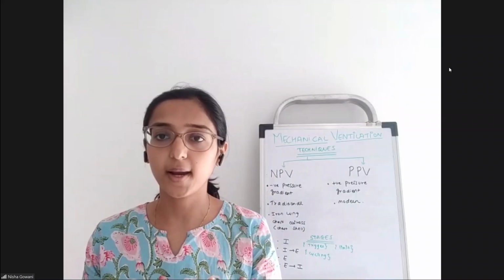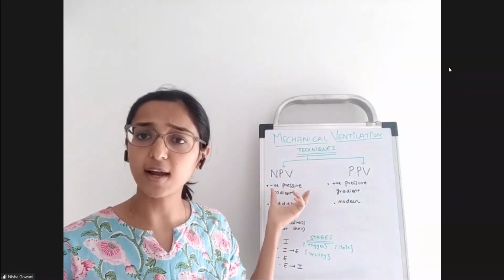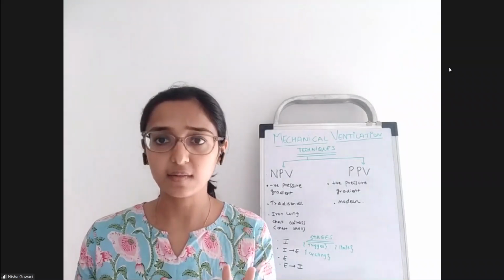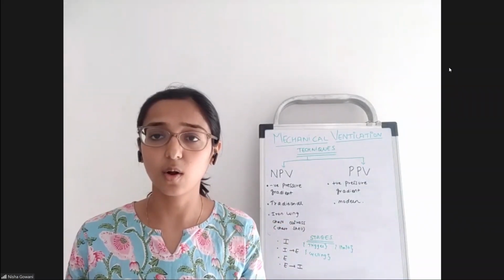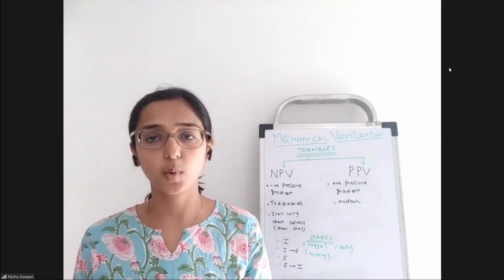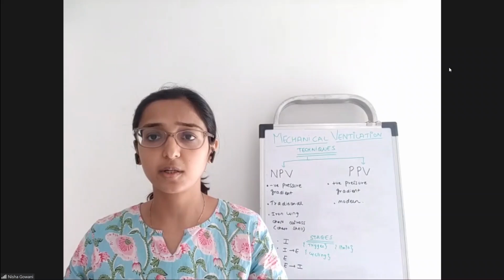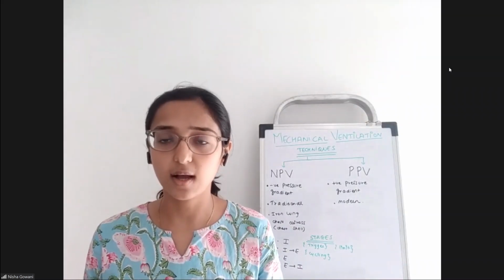This same concept was applied to the mechanical ventilator, and that gave rise to negative pressure ventilation. There are two mechanical ventilators which do that. One of them is the iron lung. This iron lung came into widespread use during the polio epidemic. Many patients had respiratory muscle weakness, and the iron lungs were widely used.